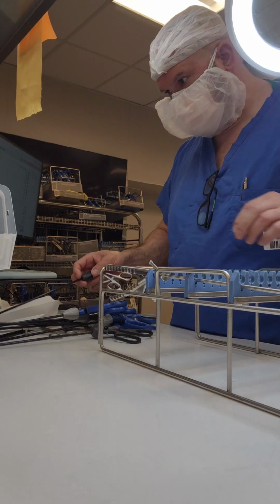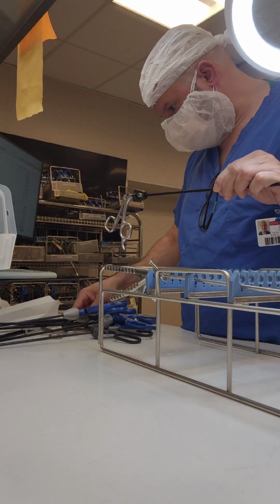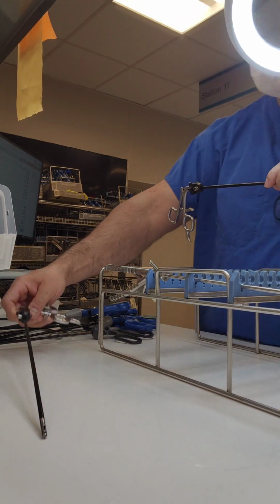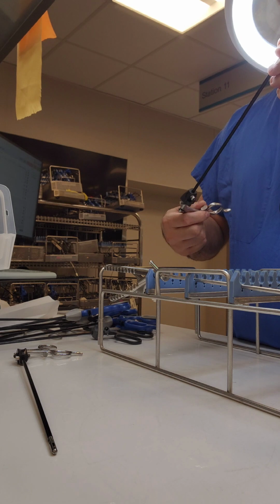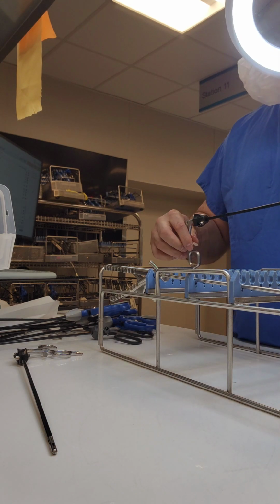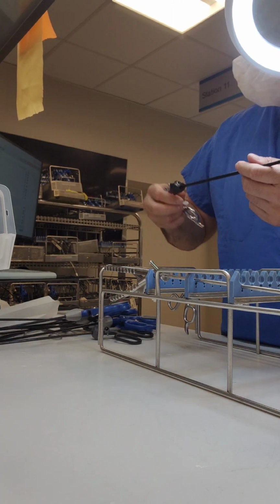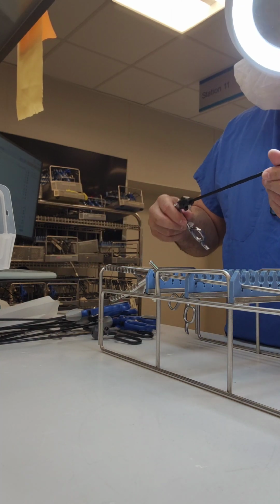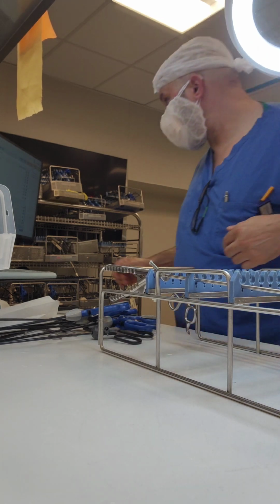Okay, making some room here. All right, time to look at these singles. Now, I was looking for its partner there, so it's two of them. Checking those jaws out, because that's the part that's going to be nice and dirty, the jaw. All right, and then place it on the rack. Making sure everything goes in there nice and smooth.